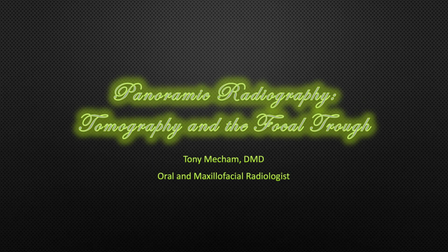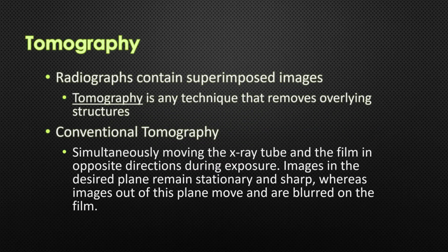Panoramic radiography can be a tough subject to learn, especially for new dental students. Its geometry is pretty complex, and to really understand it, we need to understand what tomography is, because panoramic radiography is a form of tomography. So this video is going to cover tomography and what the focal trough is.